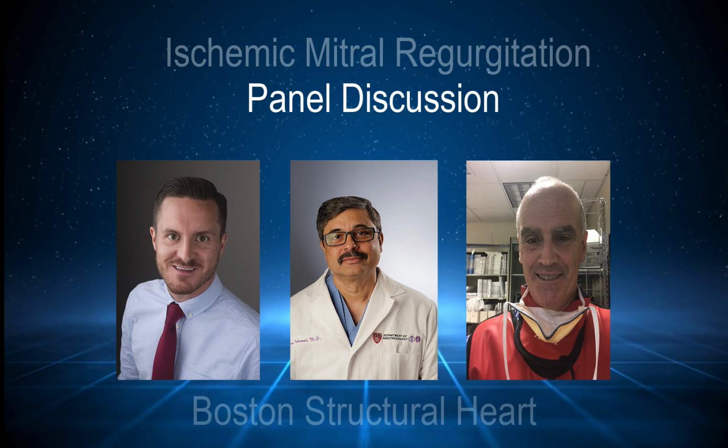It's just not as predictable because your flow convergence area is just not reliably circular, and it's based on a lot of geometric assumptions. Right. Perfect. I think this quantification of mitral regurgitation could be the subject of another podcast. And let's get some controversial cases and put it out there and see how you quantify with it.